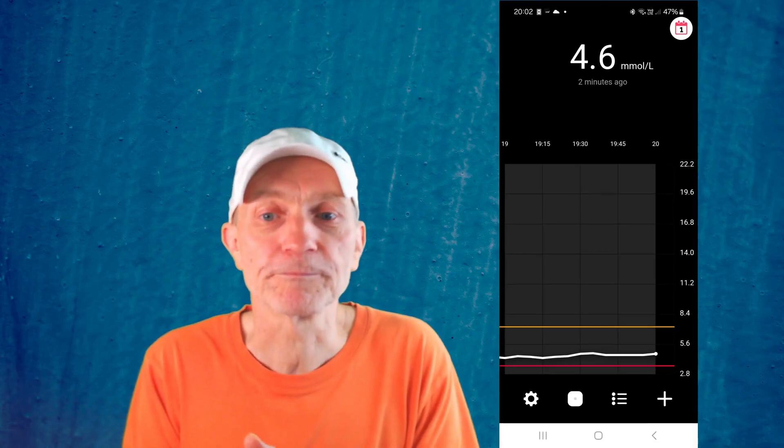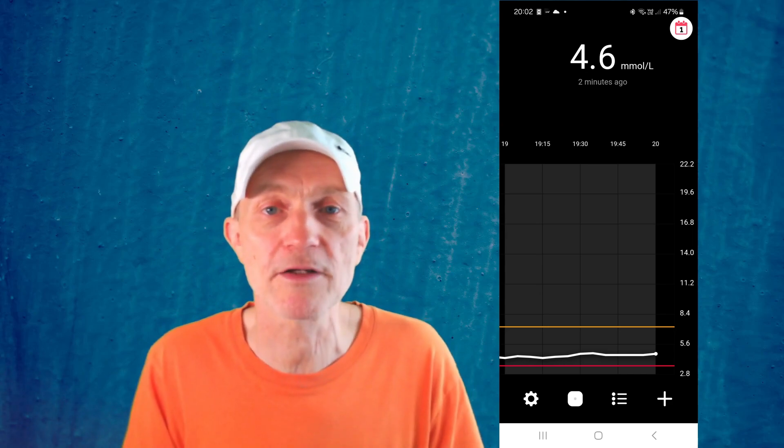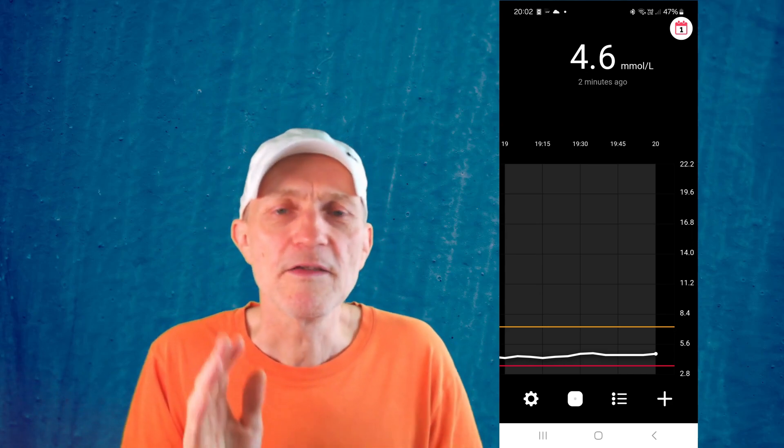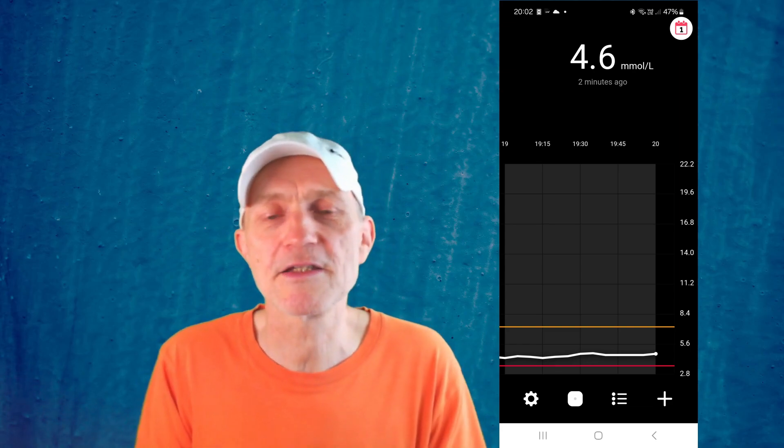The physical sensor is important, but ultimately you interact with it via the app on your phone. Let's have a look at the app and how I think it compares to competitors such as Freestyle and Dexcom. The main display on the Simplera is actually good.